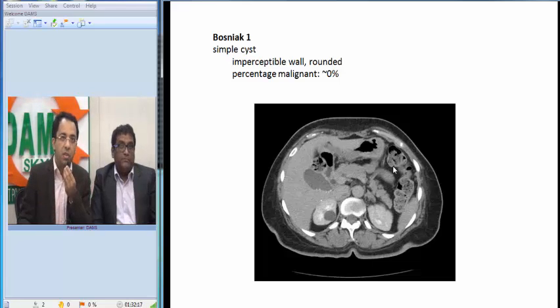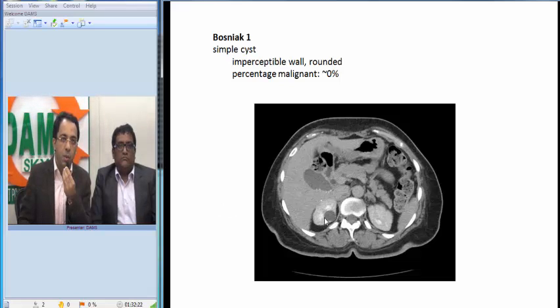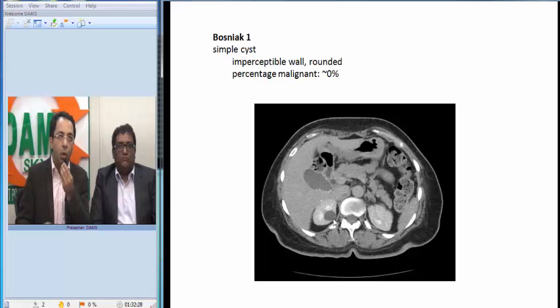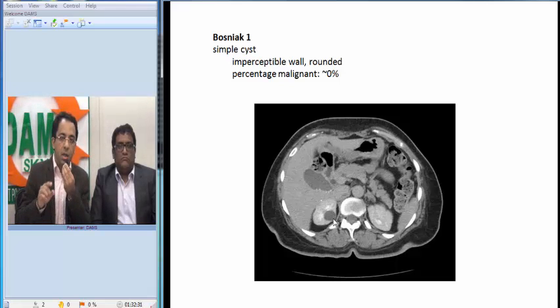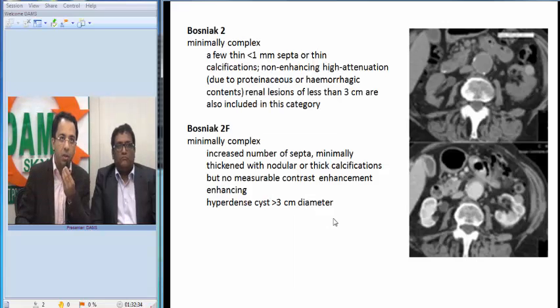Bosniak category 1 is a simple cyst with an imperceptible wall — a well-defined, rounded cyst with no malignant potential. We very often see such cysts incidentally. You cannot see the wall, no septae, no internal architecture — a simple fluid-containing cyst, well-defined and rounded, with no malignant potential. This is similar to many of the cysts we saw in our patient.